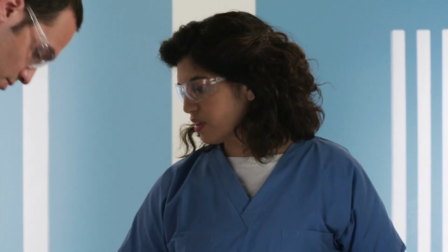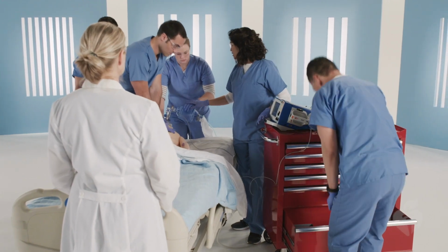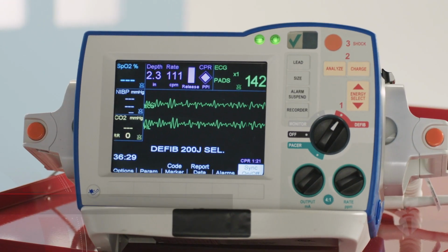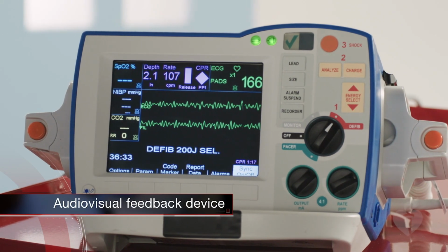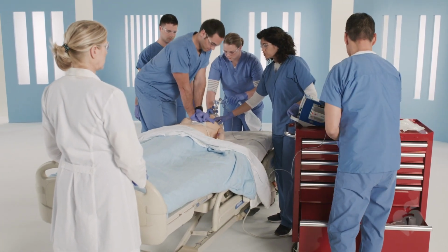The presence of a CPR coach allows the team leader to focus on other elements of cardiac arrest care. Whether you are a basic life support provider or an advanced life support provider, the role of CPR coach exists to help you and your team deliver high-quality CPR. The most effective way to implement the role of a CPR coach is with a real-time audio-visual feedback device. We'll discuss some of the functions of the CPR coach and how they use feedback devices.